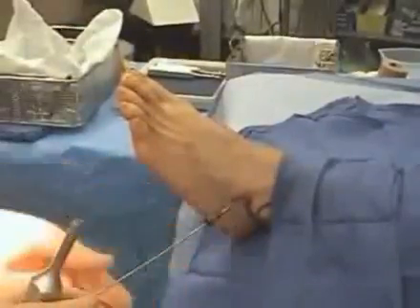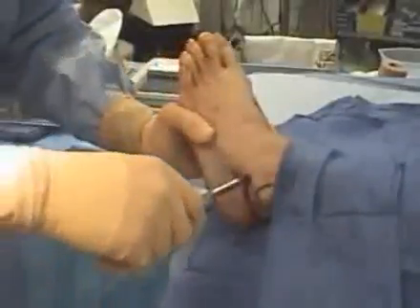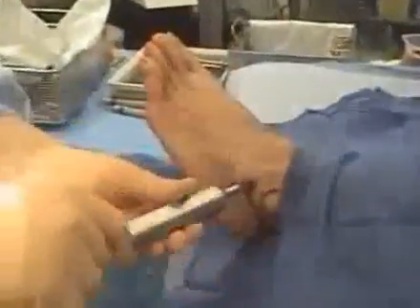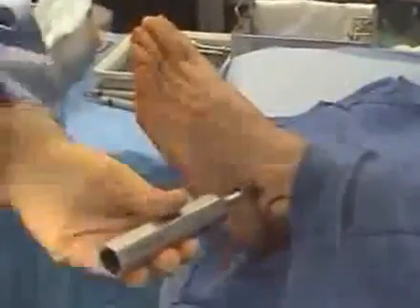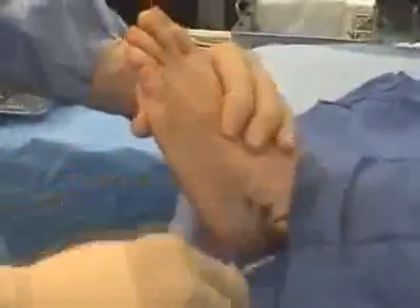So here's our number 6 stent. We're going to put it on the guide wire, put the driver on top of that, and load it into the area there. Push it into the sinus tarsi. Remove the guide wire, remembering the angle, and just push it in until it won't go in anymore, and give it a couple of spins to lock the threads into the soft tissue. It's not going to tighten down.